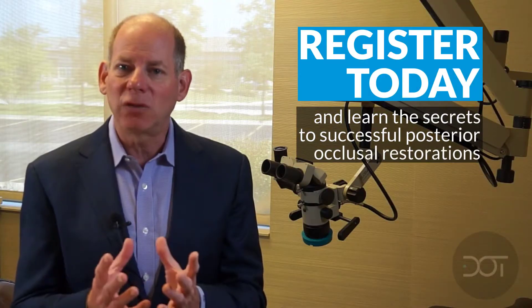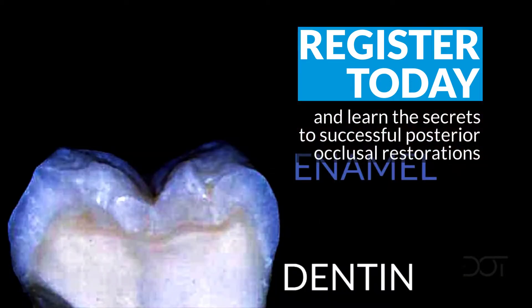It's important that we have great bond strength to our dentin, but what's critical is that the enamel rim around the periphery — especially on an occlusal restoration — is completely sealed.